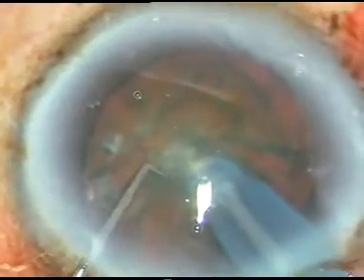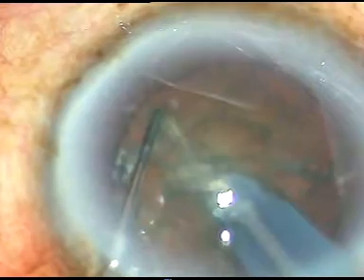So far there is no problem at all. The nucleus has been nicely chopped. The nucleus is being chopped at another place. Now emulsification of this free nuclear fragment is done — and see what happens.